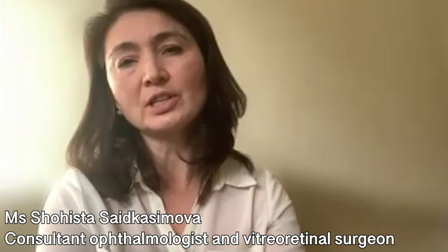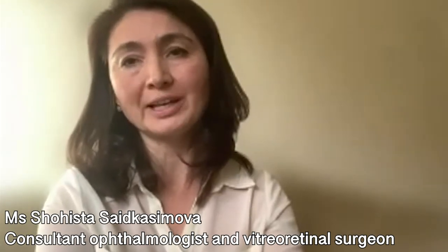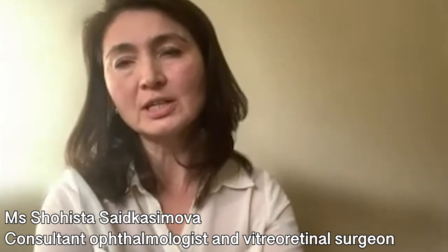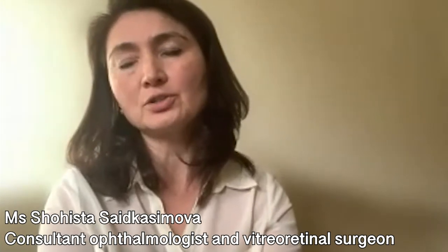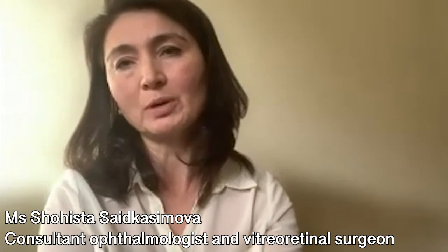Another complication that is very rare but very significant is something that we call suprachoroidal hemorrhage. That usually happens if there's a discrepancy between the blood pressure being elevated and a soft eye during the intraocular steps, when the pressure in the eye becomes quite low.